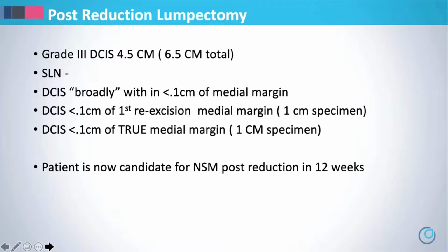And it doesn't behoove me to show you the cases where I've had negative imaging and negative margins because there's really nothing to show, except that I was able to utilize this technology and allow patients to have re-excisions intraoperatively and save a second operation.